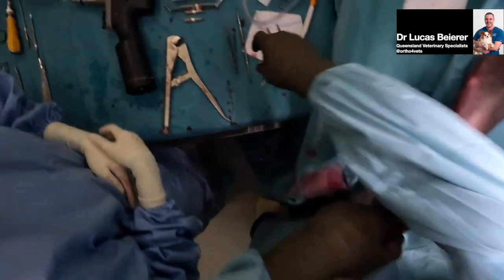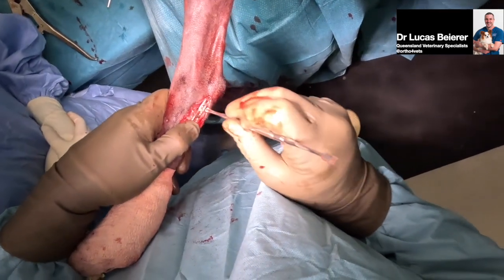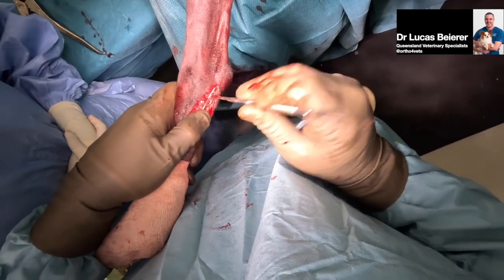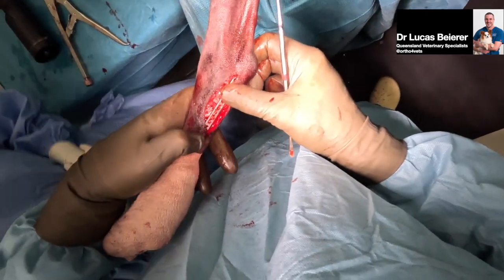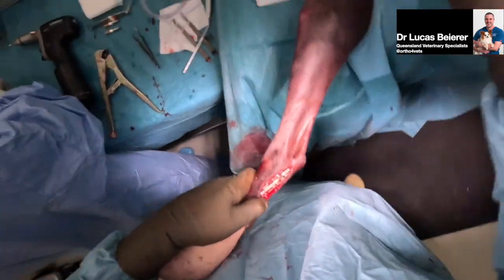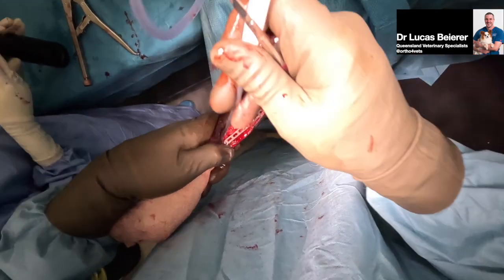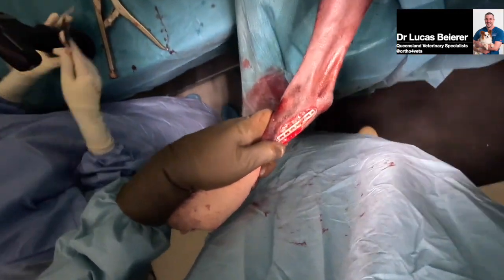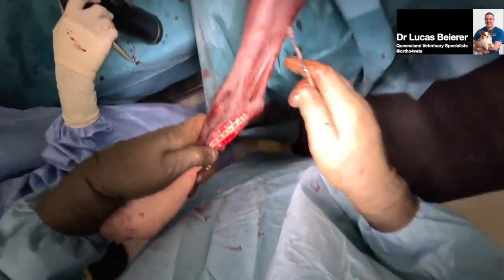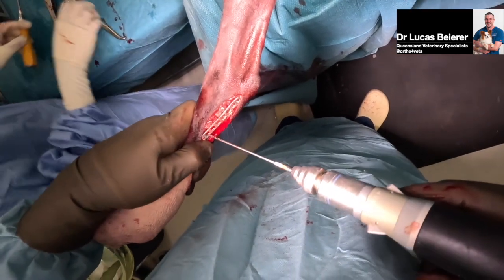And then we'll probably place this majority locking, because it's pretty well contoured, pretty well positioned, I think. Maybe a cortical there. Let's go with the cortical at the top of the metatarsal. Remember that the metatarsals fan out like a U-shape, so you can't reasonably get across all four of them, and anyone that tries is kind of not being entirely genuine.